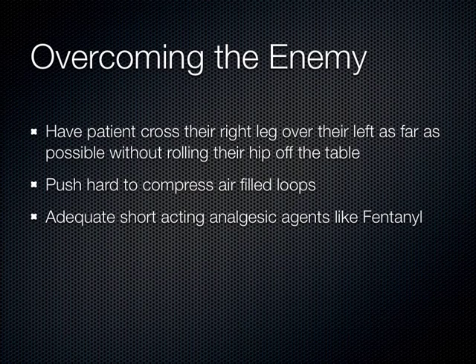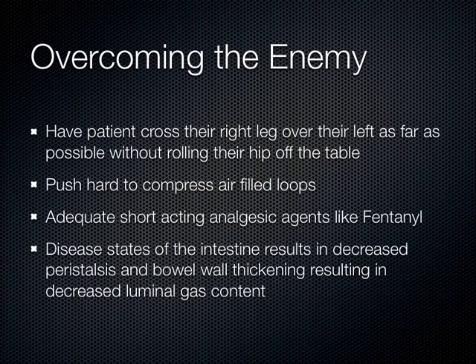People say ultrasound is a very operator-dependent thing. Some people are good at finding the appendix, some people aren't. No. Appendicitis is a very fentanyl-dependent thing. You guys know what fentanyl is, a narcotic, short-acting, lasts 20 minutes. We use it a lot in patients who have acute pain in the emergency department. I can give someone a good slug of fentanyl, and it really does take the edge off their pain so that I can compress and get into their abdomen using ultrasound. It's a much more humane way to do than what we're going to do today to our models.